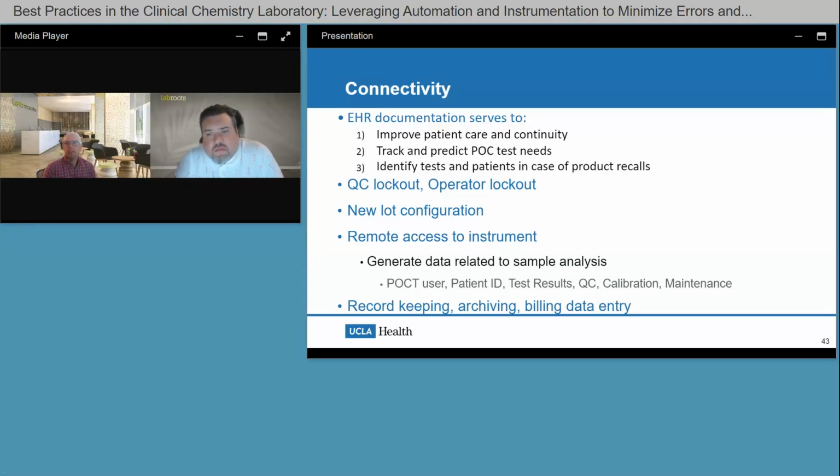We can validate those systems, looking at things like hemolysis index, potassium values, lactate dehydrogenase, for example, which are known to be affected by these types of systems. We can also validate when they're coming from different locations. So yes, I think it's a convenient way of transporting the system, and there's things that we can do to make sure that quality is not impacted by those types of systems.